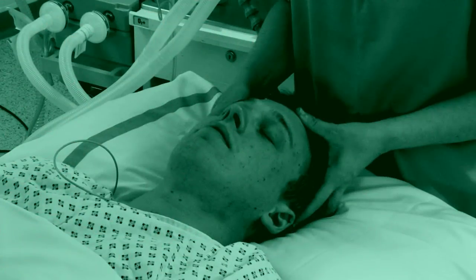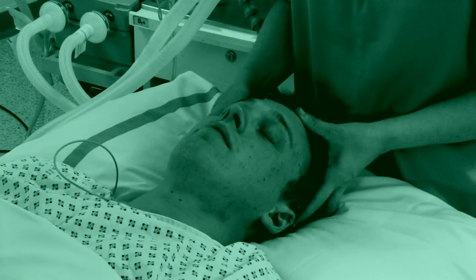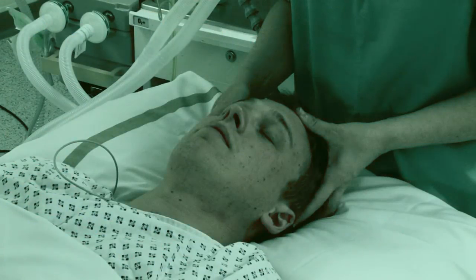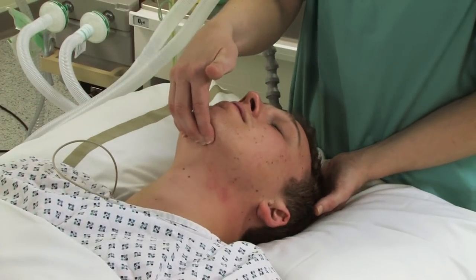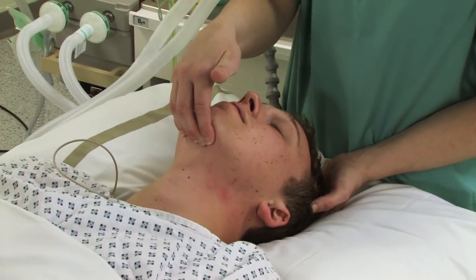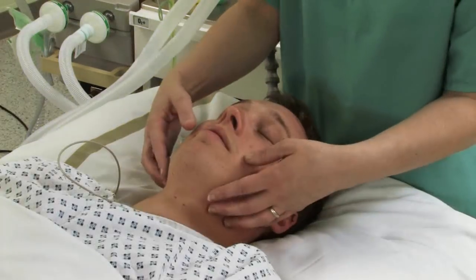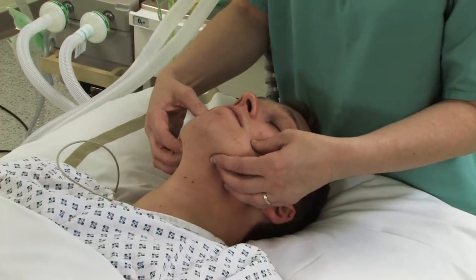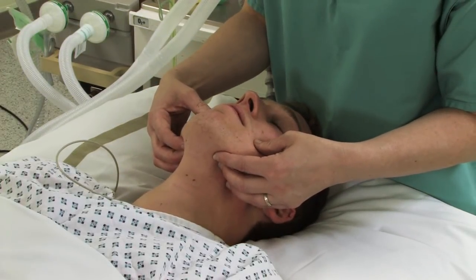Initial management of the obstructed airway calls for manoeuvres to clear the airway, these being head tilt, chin lift and jaw thrust. Suction may also be required.